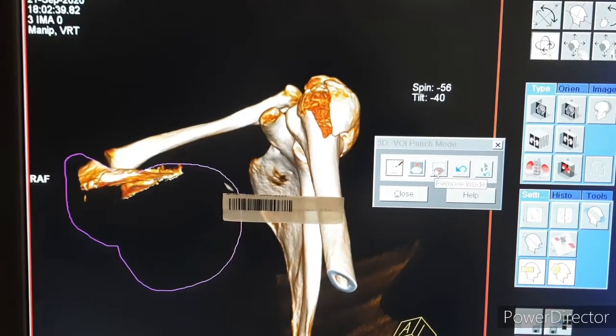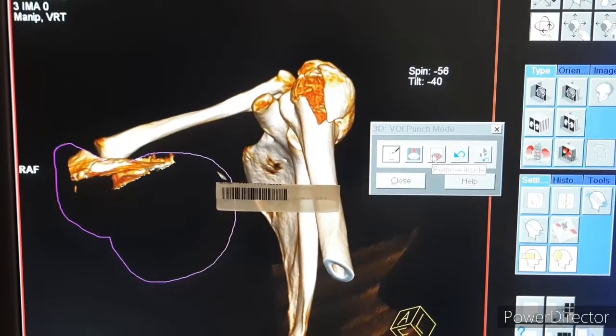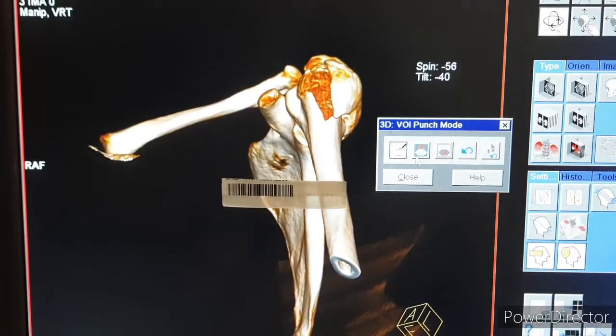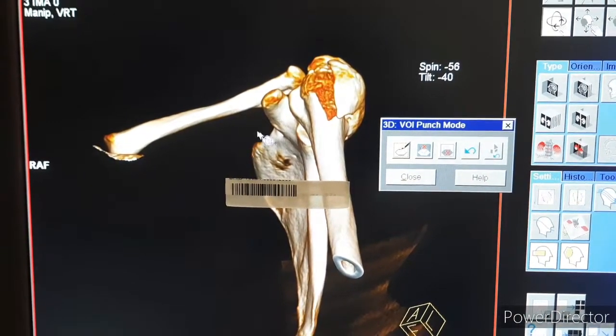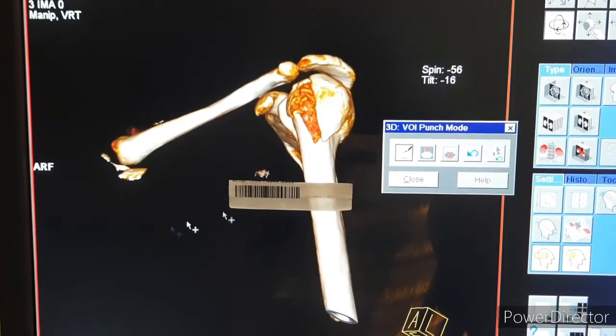You can select 'Remove Inside' or 'Keep Inside' depending on your cutting style.